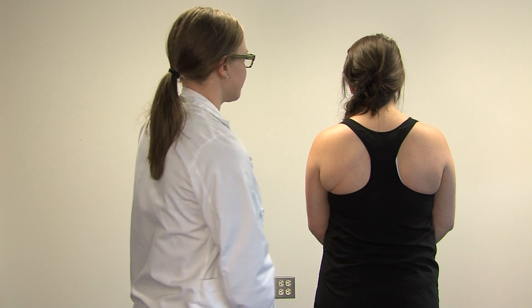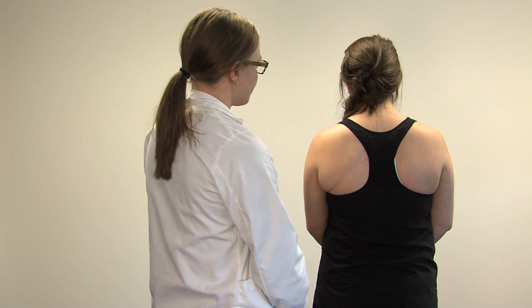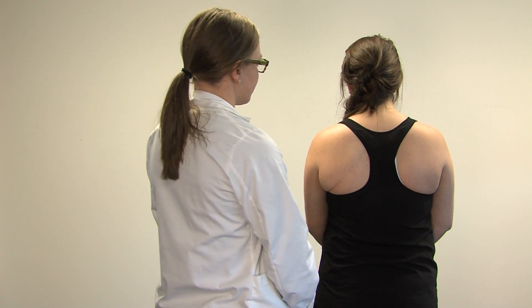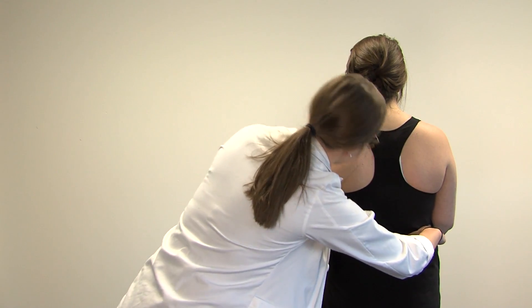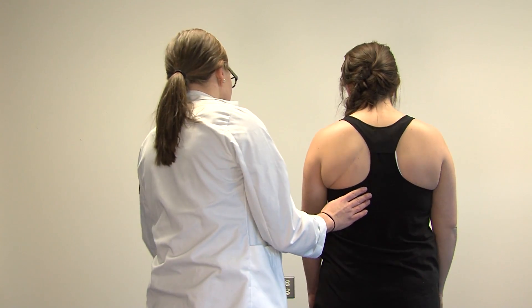Now I will demonstrate a normal exam. First we do a general inspection of the back. Then we check to see if the shoulders and iliac crests are level. Next we do the Adams forward bending test with the scoliometer.